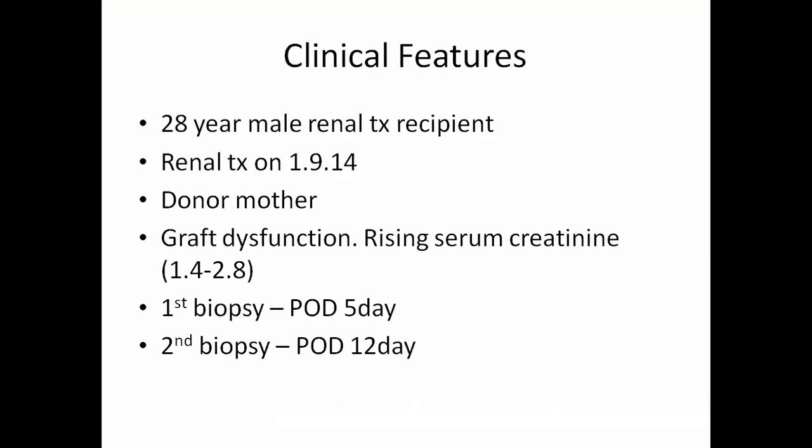So I'll show you another case. A 28-year-old male renal transplant, which was done in 2014. There was graft dysfunction, a rise in serum creatinine from 1.4 to 2.8. The first biopsy was done on POD5, and the second biopsy was done on POD12. So this is the first biopsy.